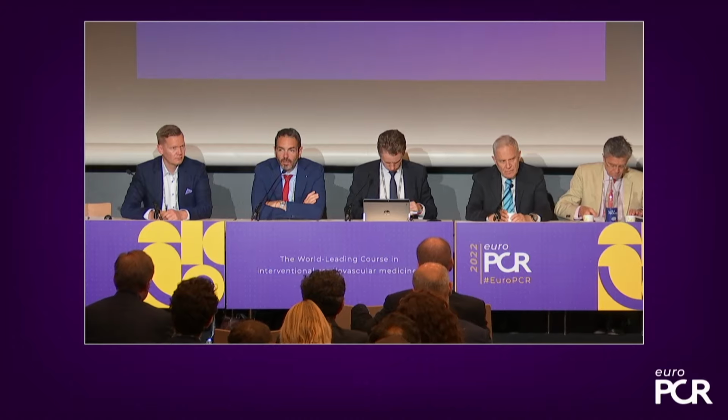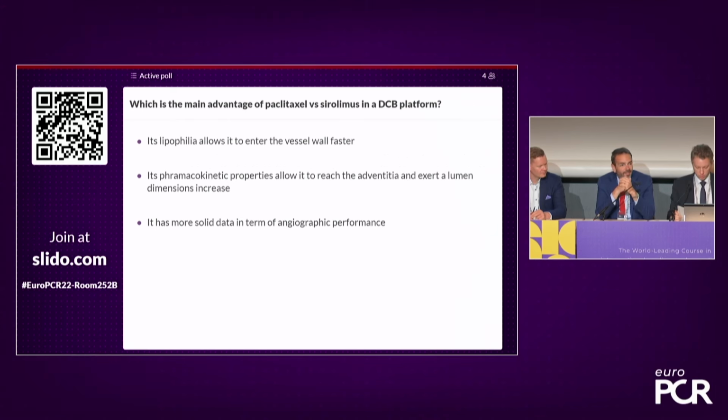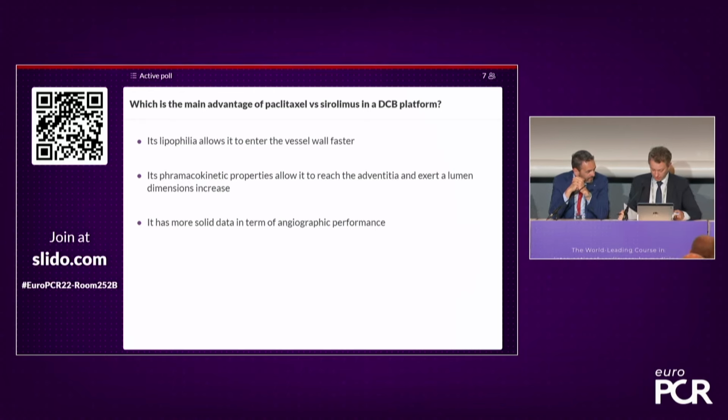Thank you, John. Very nice didactical case with the lumen gain, which is one of the most fascinating topics in the DCB for Paclitaxel. Now we have the discussion time, but first I would like to launch the poll. So I invite you to vote. I'm going to read the question: which is the main advantage of Paclitaxel versus sirolimus in a DCB platform, in your opinion? Its lipophilia allows it to enter the vessel wall faster. Its pharmacokinetic properties allow it to reach the adventitia and exert lumen dimensions increase, or it has more solid data in terms of angiographic performance? So we'll allow a couple of moments for you to answer that via the app.